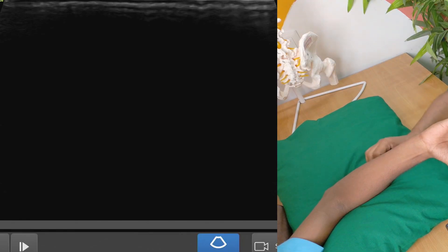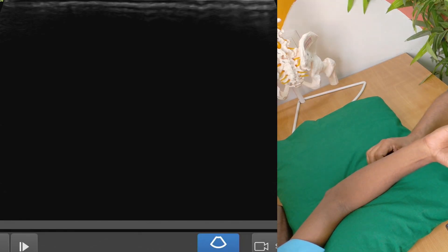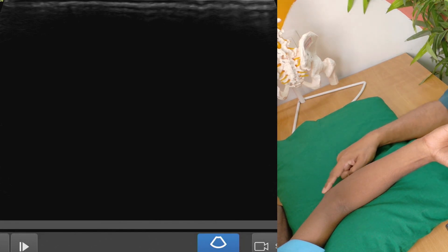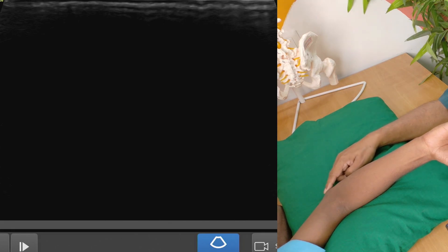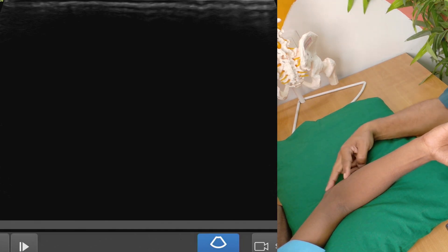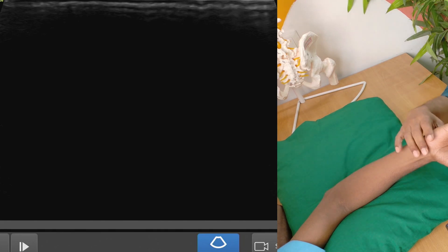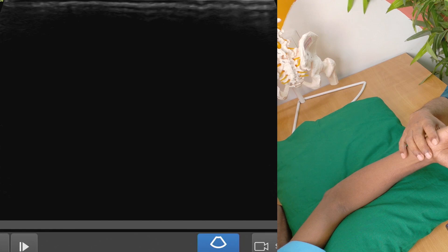We are demonstrating the common flexor tendon, which as you know is getting attached over the medial epicondyle of the elbow. We will be palpating the medial epicondyle and holding the probe like this, keeping the aspect marker towards the proximal side. The patient will be slightly externally rotating the hand, and can be in a sitting or supine position.